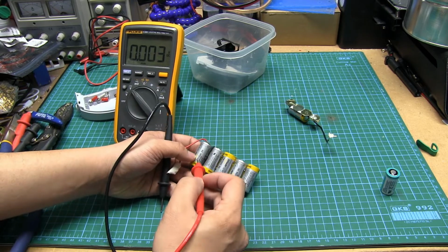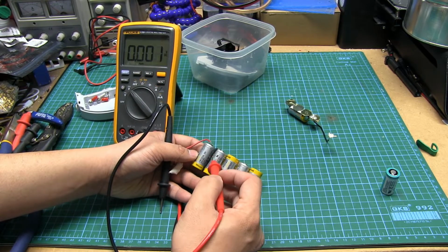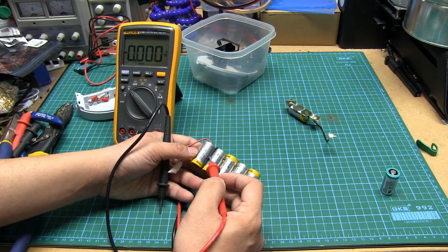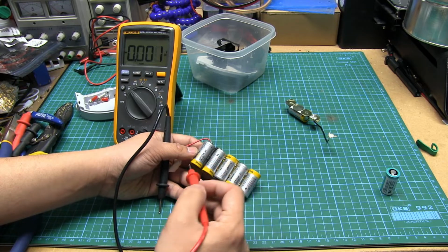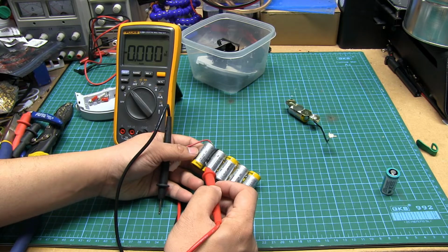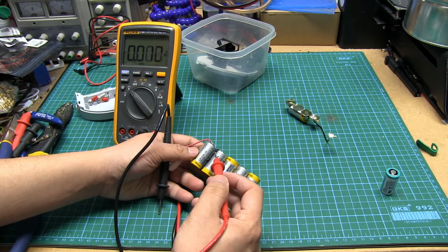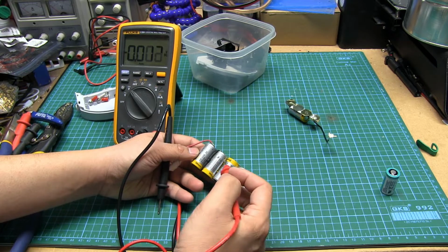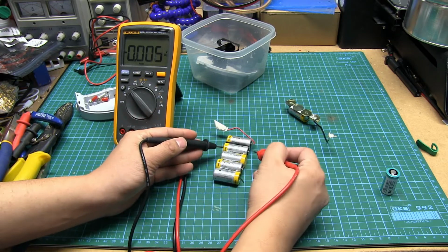I just noticed that the first cell in the series here is doubled back upon itself. There's a component underneath this heat shrink between these 2 cells. It could be a thermal fuse. It could be a one-off, like just an actual fuse that if it blows, it's done for good. But yeah, let's take a look at the other cell voltages, see where we're at.